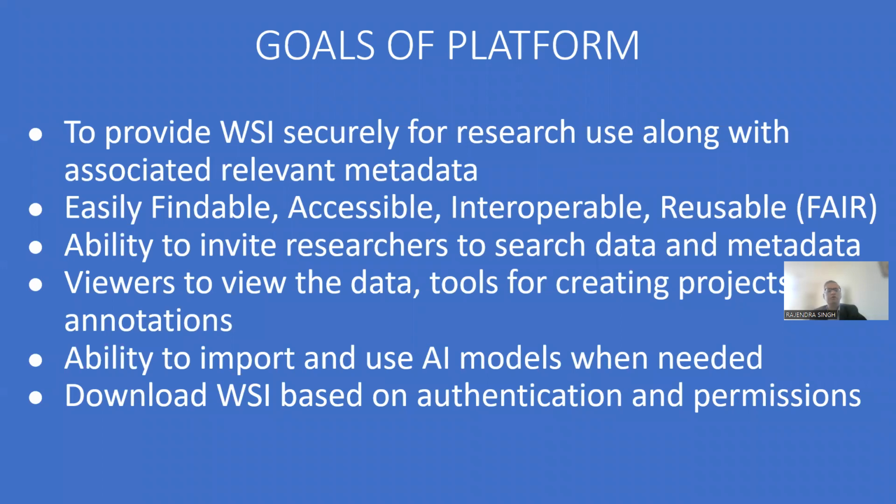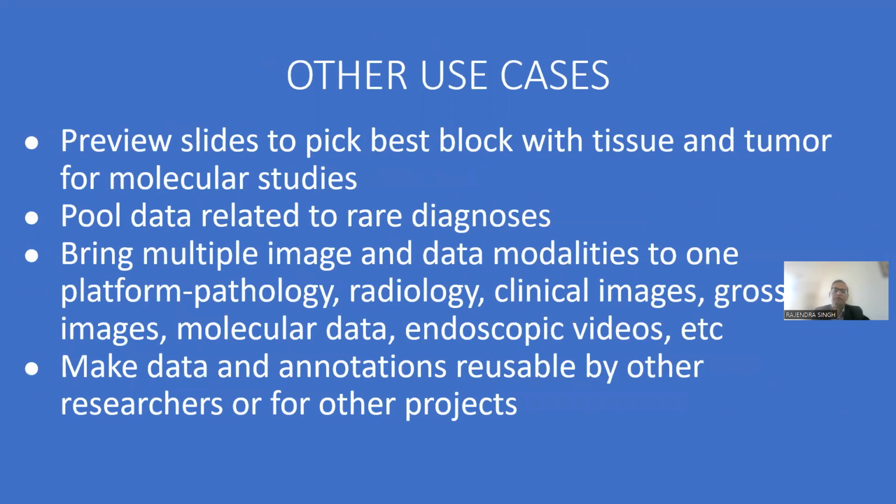The admins of the platform have the ability to invite researchers to search the data along with any kind of metadata that is associated with the whole slide images. It also provides viewers to view the data and tools for creating projects and annotations. The researchers have the ability to import and use any AI module that they would like for the research. And based on authentication and permission, they would be able to download the slides if needed.